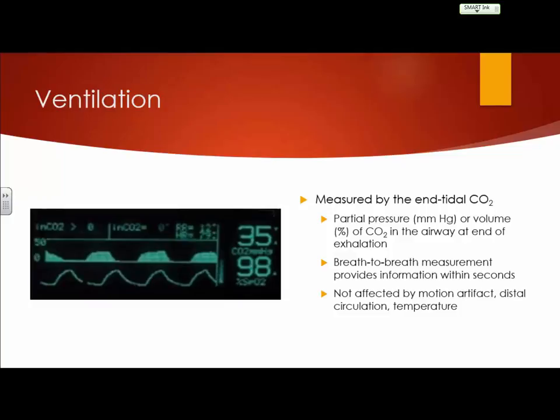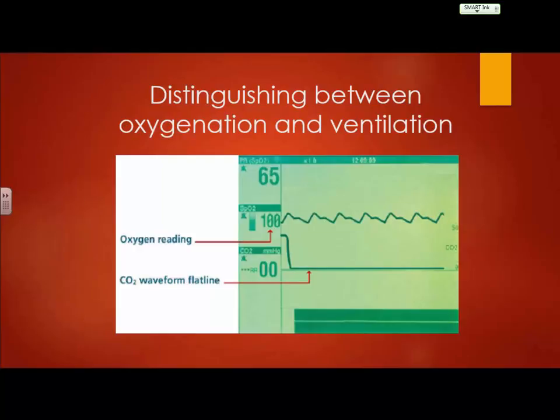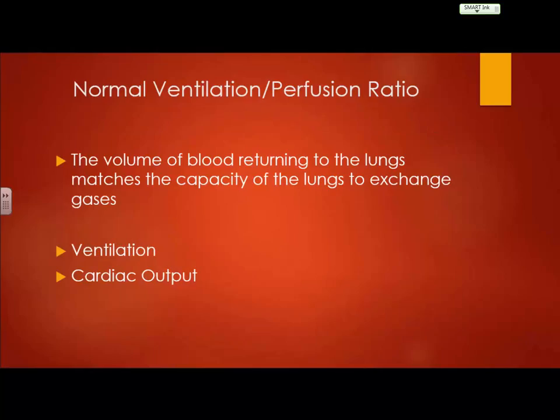But all in all, if you put this on, it should give you what you need to know as far as when you've intubated a patient or when you put on the nasal cannula. Right. So now with your SpO2, it will sometimes give you a plethora of waveforms, but we're not going to talk about those waveforms today. But do know that you can have those. If you're measuring CO2, you need to make sure you've got your monitor set to where you get your waveform for your CO2 and your reading there as well. Okay?